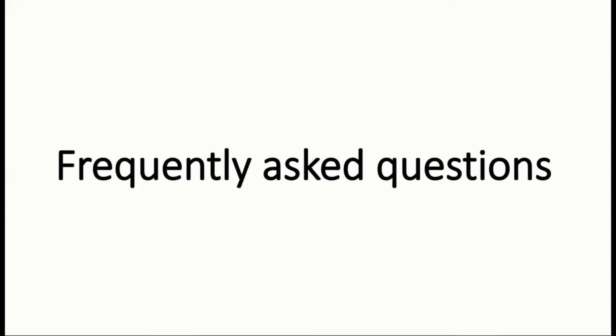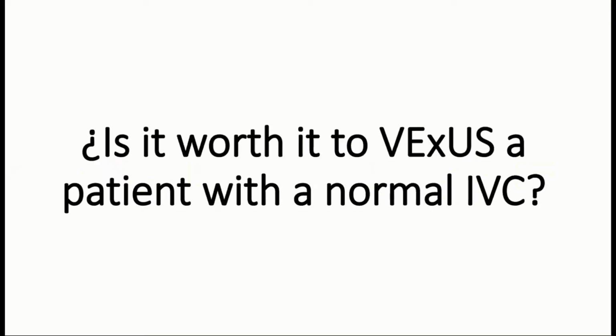And so I wanted to go ahead and tackle some frequently asked questions that I have gotten when I've given this lecture previously. I hope they will help you understand VExUS better and help you interpret these alterations better in the clinical setting. So, one of the most frequent questions we get is: is it worth it to VExUS a patient that has a normal IVC? And the answer is no, of course not.